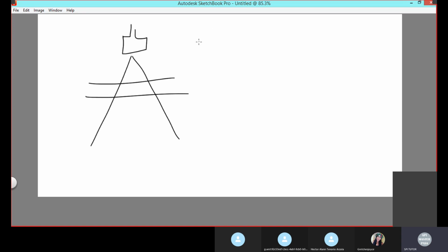So instead, what we focus on is, what is the direction of blood? Is it left to right or right to left? Okay, the colors will still show towards me and away from me. The colors will still show that, above the baseline, below the baseline. But now we're looking at right to left or left to right when it's a completely perpendicular vessel like this, completely straight.